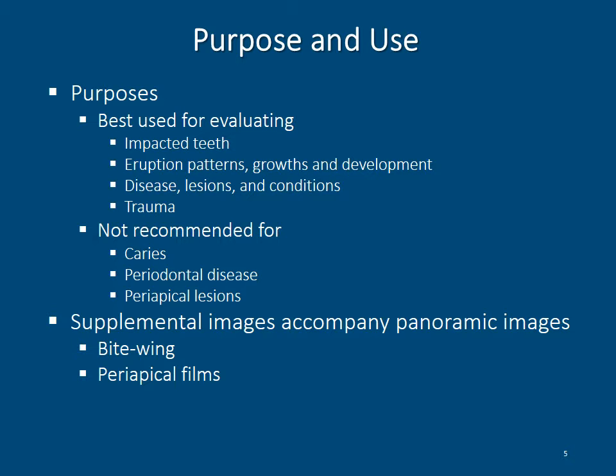Typically, bite wing radiographs vertically placed as opposed to horizontal are preferred, and these bite wing series complement or complete a panoramic radiographic series. Periapicals are recommended only when there are specific areas that require more attention. Therefore, there is no standard periapical radiograph that is normally taken, but it would be on a per patient needed basis.